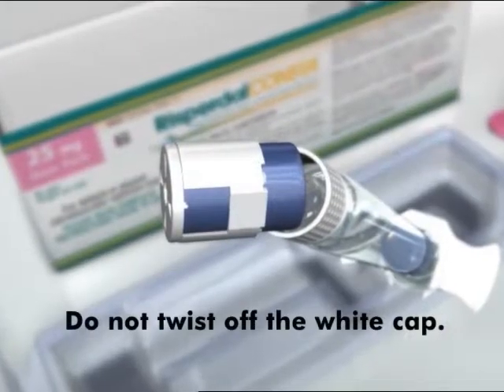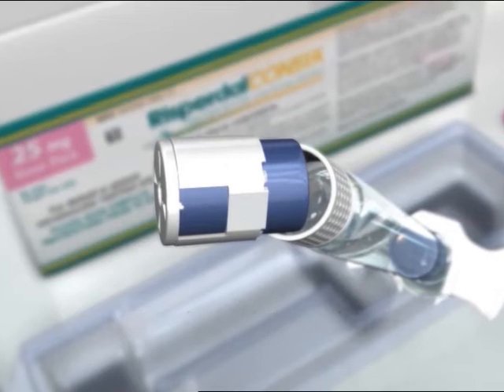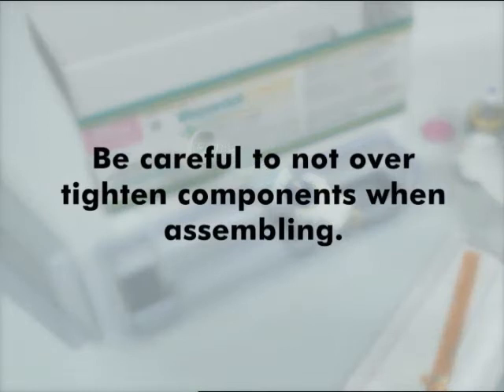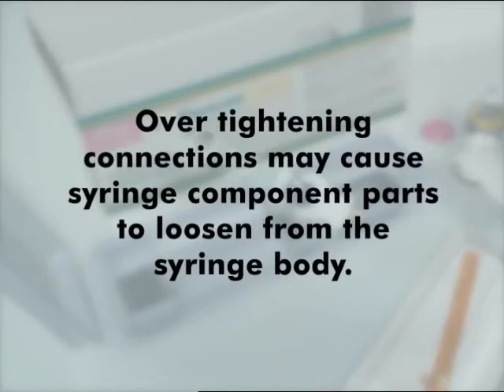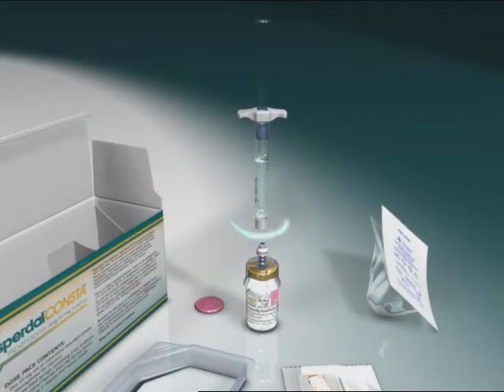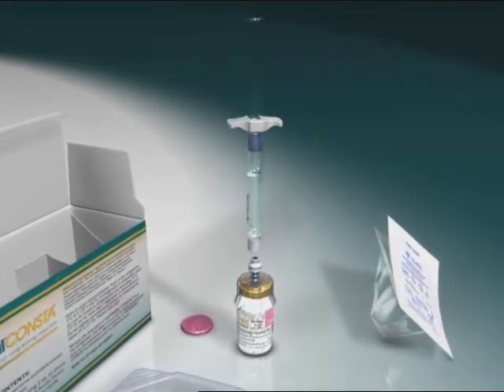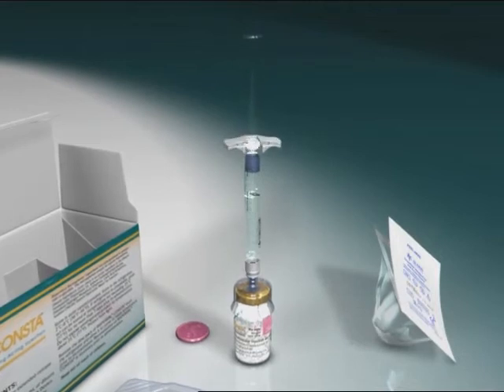Do not twist off the white cap. Remove the white cap together with the rubber tip cap inside. For all syringe assembly steps, hold the syringe only by the white collar located at the tip of the syringe. Be careful not to over-tighten components when assembling, as over-tightening connections may cause syringe component parts to loosen from the syringe body. Do not hold the glass barrel. While holding the white collar of the syringe, insert and press the syringe tip into the blue circle of the SmartSight access device.